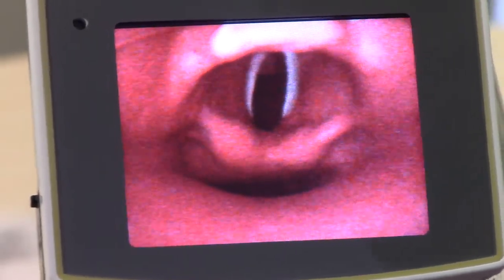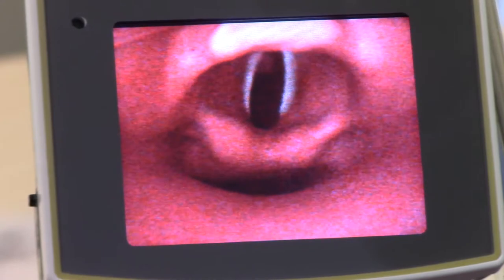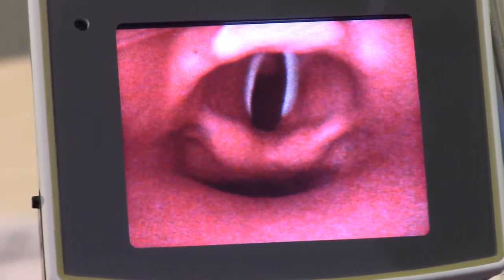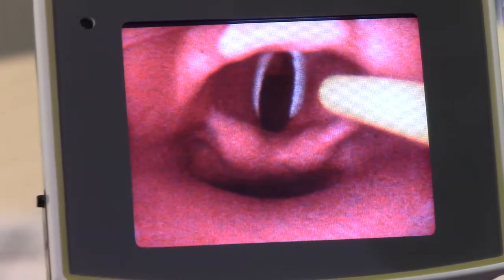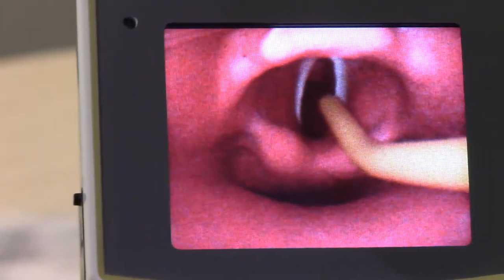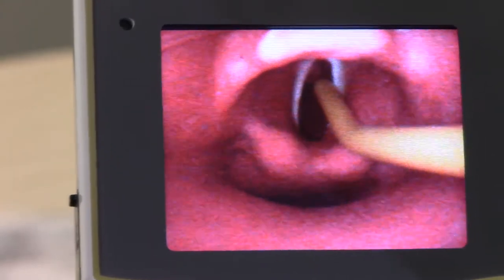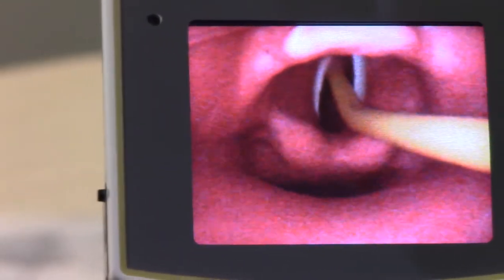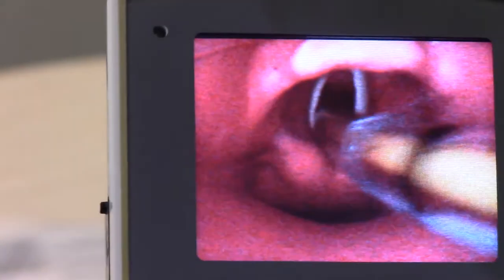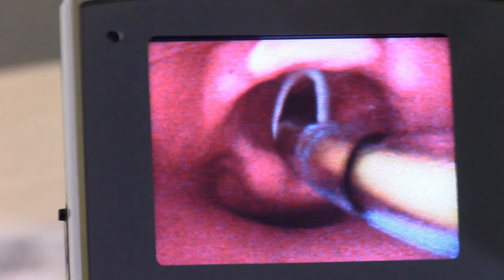The J-WAND employs a flexible angled introducer tip that more closely mimics current video laryngoscopy blade design. During the intubating process, the flexible introducer tip bypasses the piriform recess, more naturally moves towards the glottic opening, and allows the practitioner to easily and safely place the endotracheal tube, as seen here.